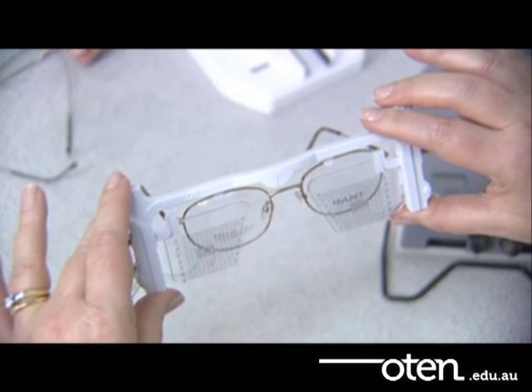The optical centre for an aspheric lens must be dropped one millimetre below pupil centre for every two degrees of pantoscopic tilt.